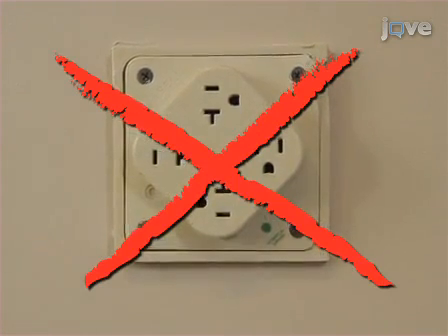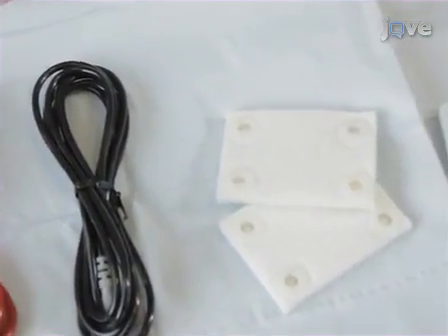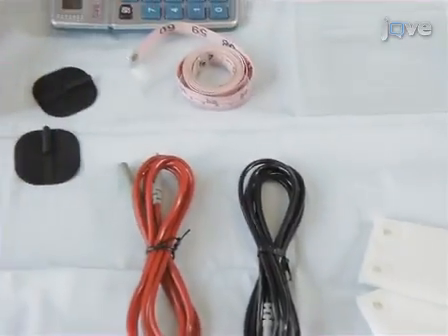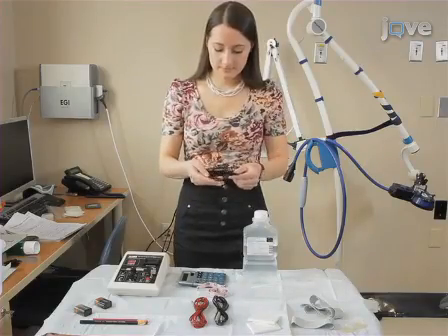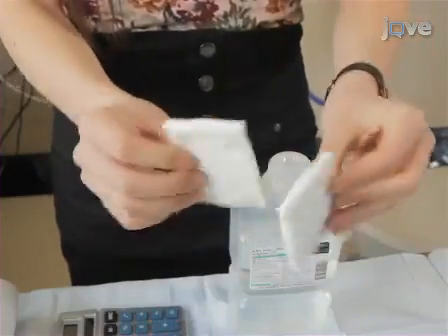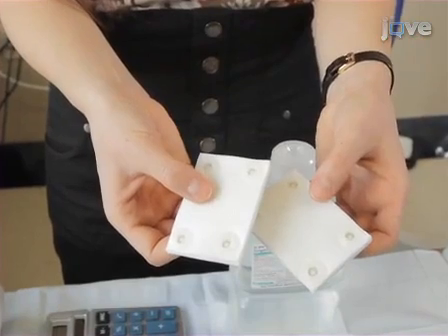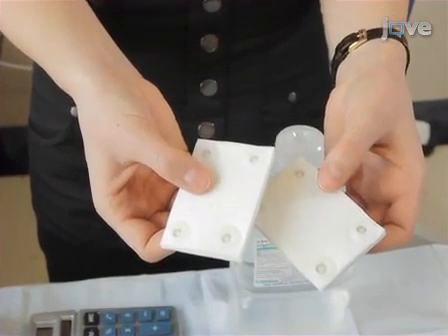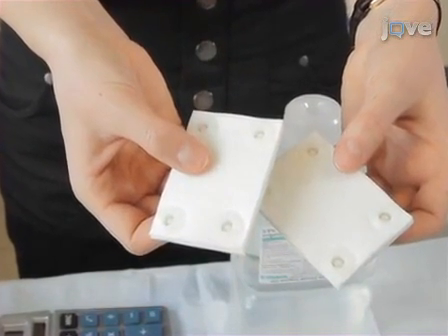without warning. The electrodes used for TDCS are generally conductive rubber electrodes enclosed in a perforated sponge saturated with electrolyte fluid. If reusable rubber electrodes are used, be sure to inspect these for wear before use. It is recommended to use perforated sponge pockets that are not too coarse, as these best absorb the electrolyte solution and provide uniform skin contact, while buffering the skin from electrochemical and pH changes.